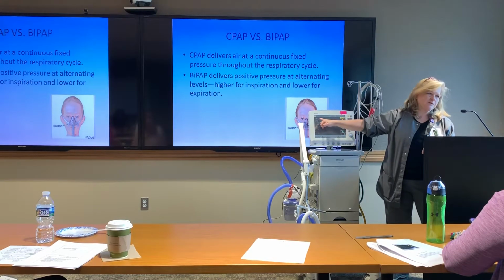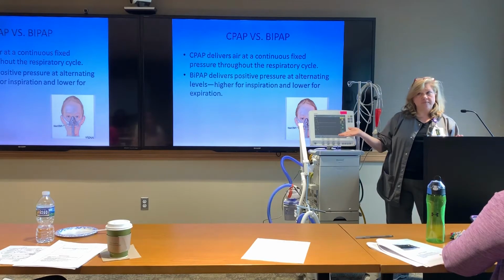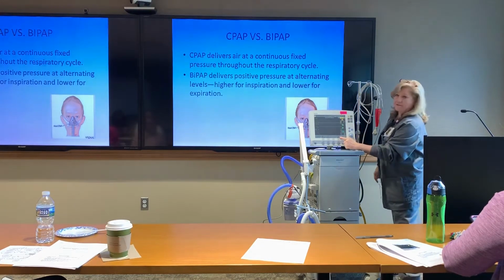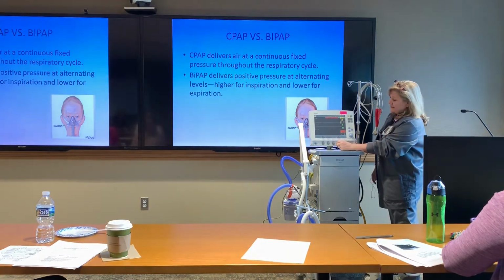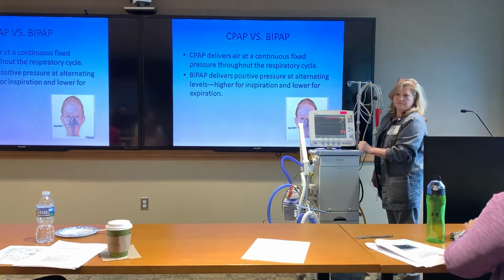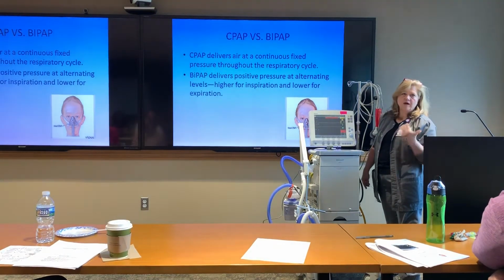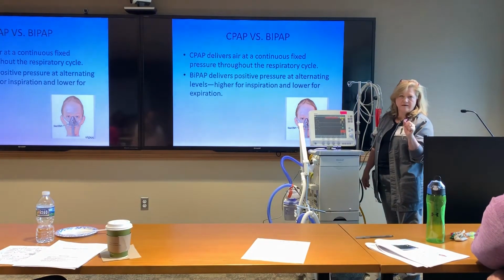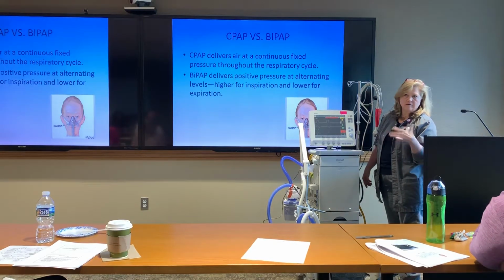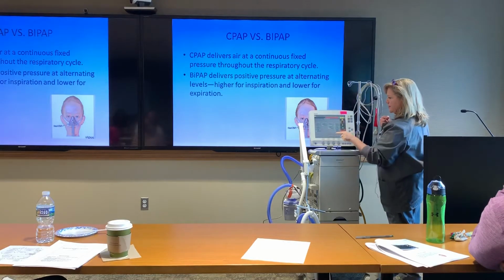You can see it'll say pressure support / CPAP. So which am I in? Am I in pressure support or am I in CPAP? Well, the answer to the question lies down here in this number. If this says anything other than 0, I'm in pressure support. If it says 0, I'm in CPAP. We never use CPAP anymore. We always put somebody on at least 5 of pressure support for a weaning trial. But that would actually be CPAP and not going apneic, so sorry.